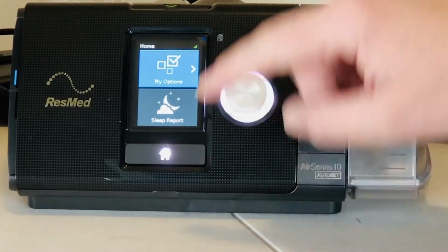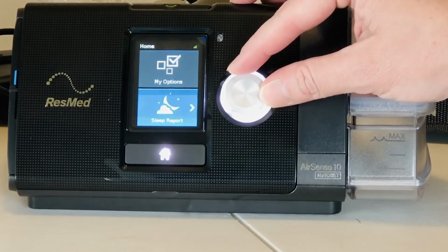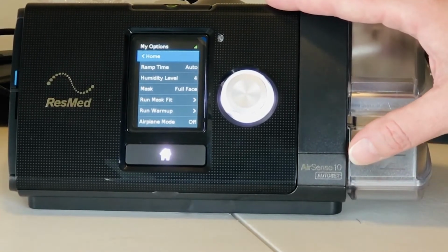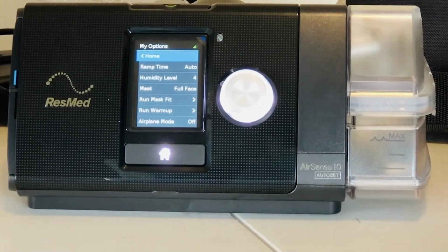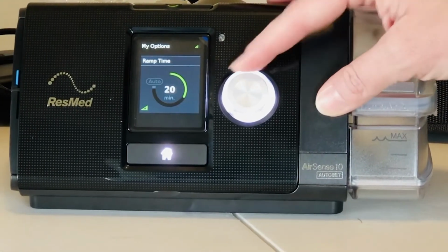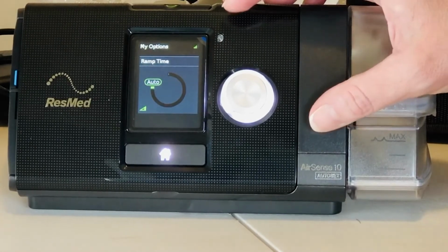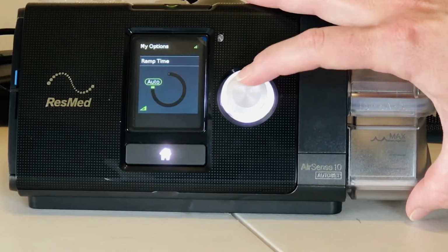By pressing this house, you will be brought to the home menu. From the home menu, you've got 2 options: My Options or the Sleep Report. By selecting My Options and pressing the circle, you can adjust ramp. Ramp means you are brought to your prescribed pressure slowly rather than quickly. Ramp can be adjusted by selecting ramp time. You can turn ramp off if that is more comfortable, or it's a time setting, 5 through 45 minutes, or to auto. Auto means the machine will sense a change in your respiratory pattern and bring you to your prescribed pressure as you're falling asleep.